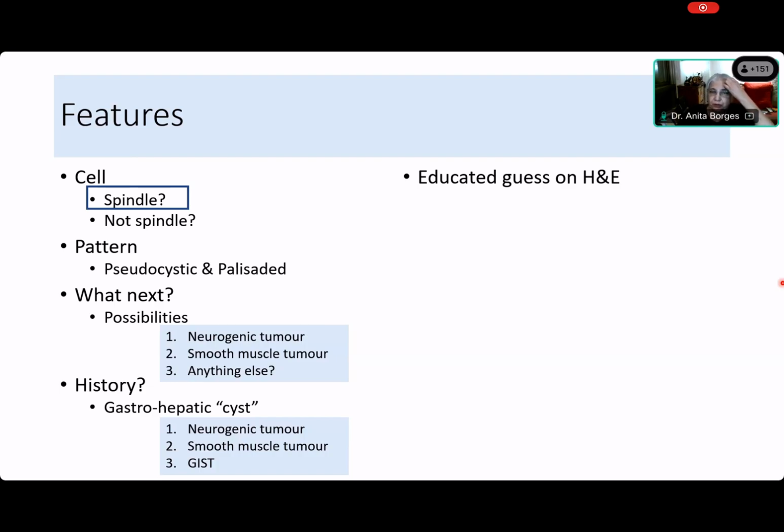Anybody doing anything in the chat box? Sorry, what are they saying in the chat box? Neurogenic. Okay, but Diksha, you said gastrointestinal stromal tumor. So if you had to do an educated guess, it would be gastrointestinal stromal tumor, because what is most common that will give you palisading, etc., and be present in the gastrohepatic space? It would be a gastrointestinal stromal tumor. So I think your guess was a good guess.